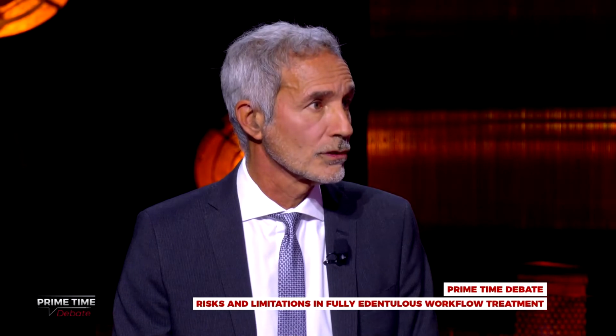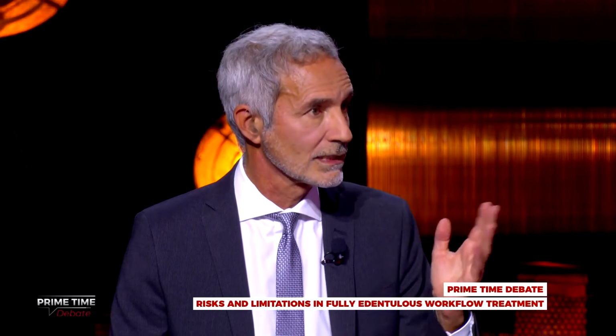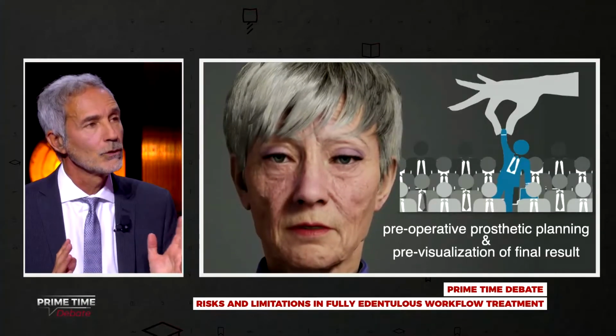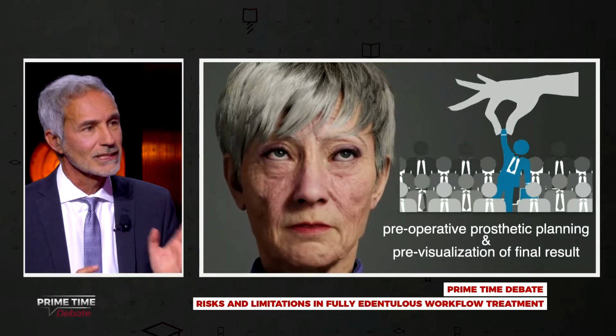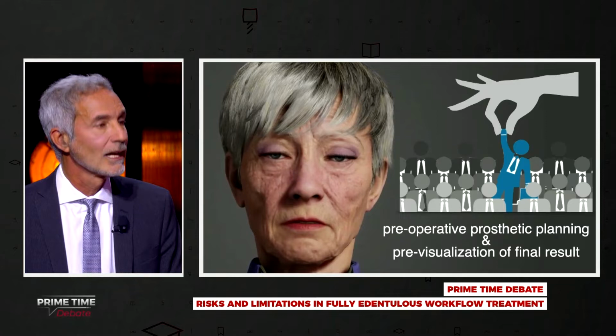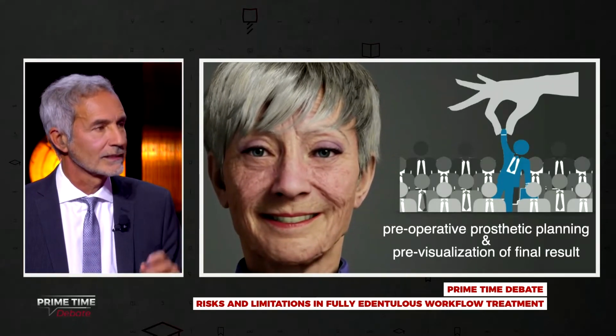Yes, in fact, this is important to start with a different approach. That means individualization of the treatment, because as I said, only a pre-visualization of the final result can help you in understanding which is the best solution for that specific patient. So pre-operative prosthetic planning and pre-visualization of the final result are mandatory for choosing the right treatment.